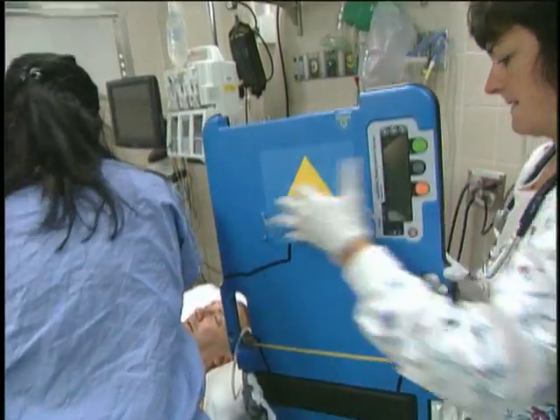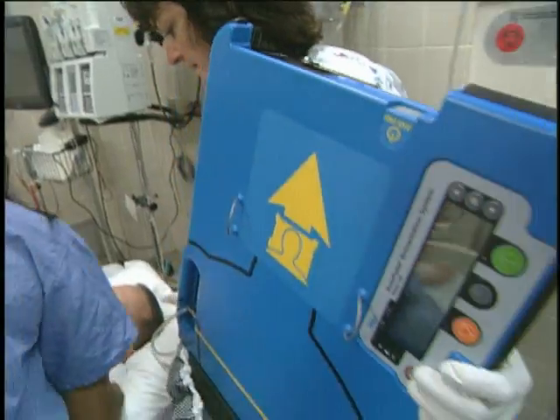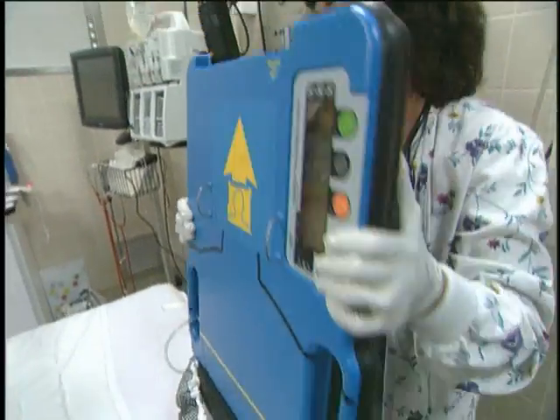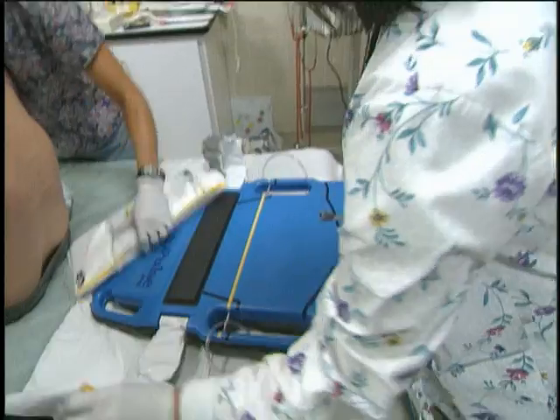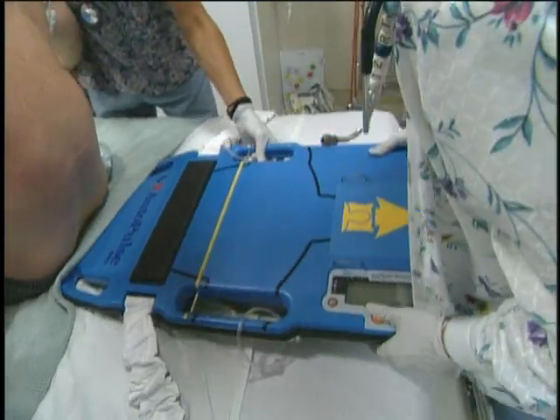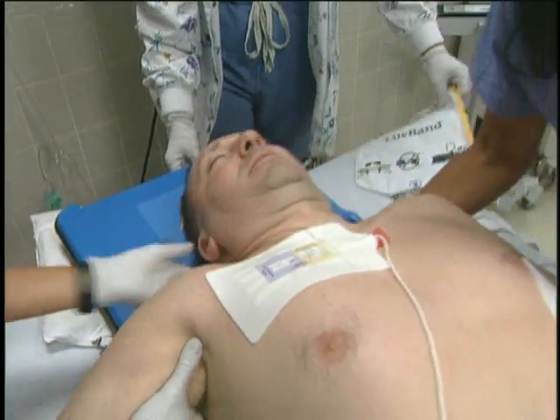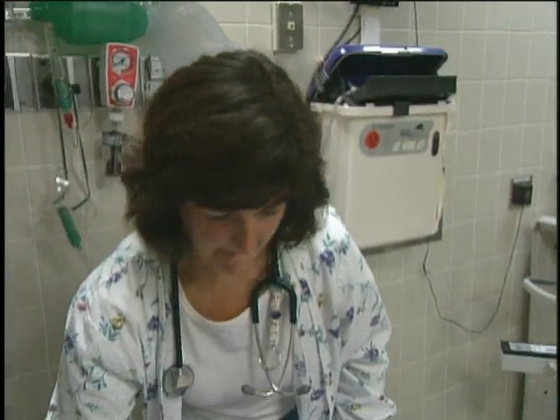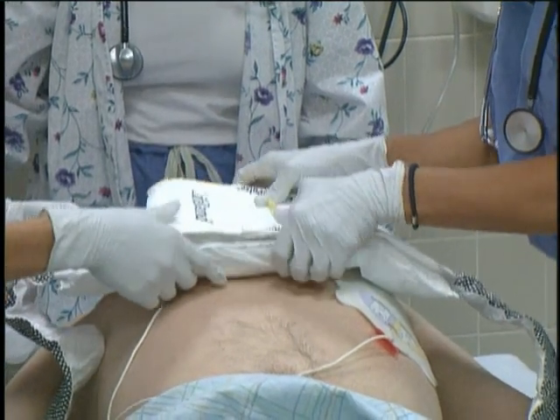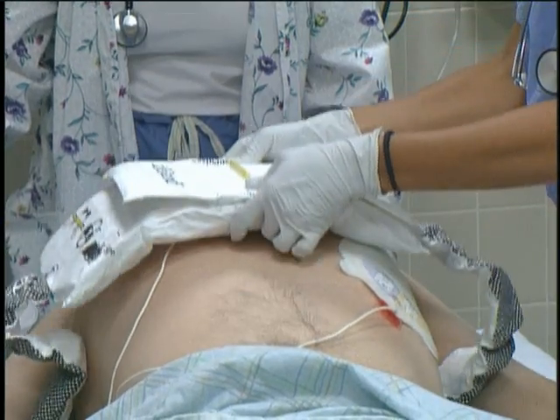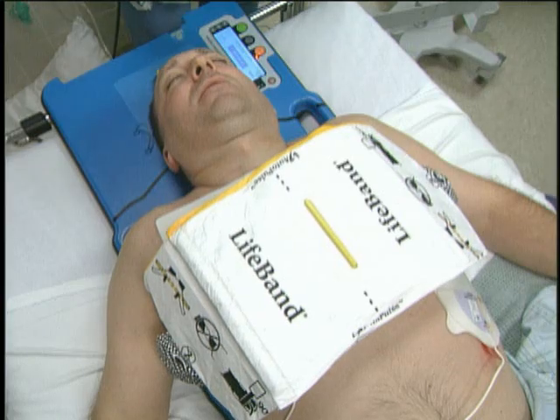Is your auto pulse ready? Auto pulse ready. Let's lift. One, two, three. Starting on the pulse.